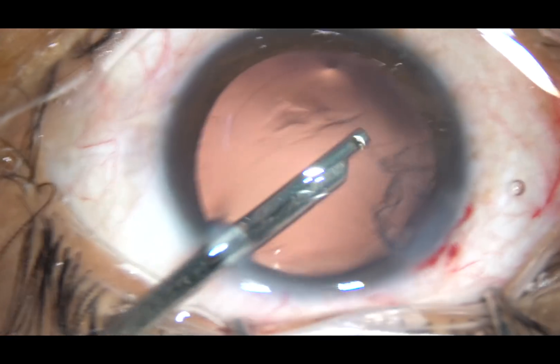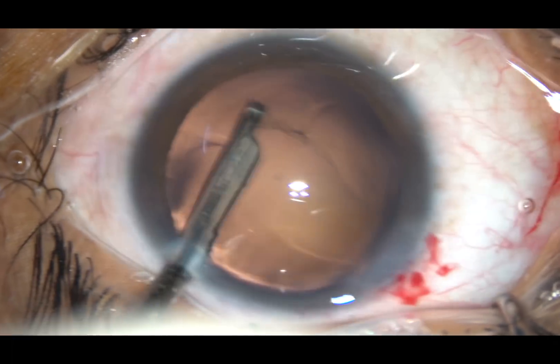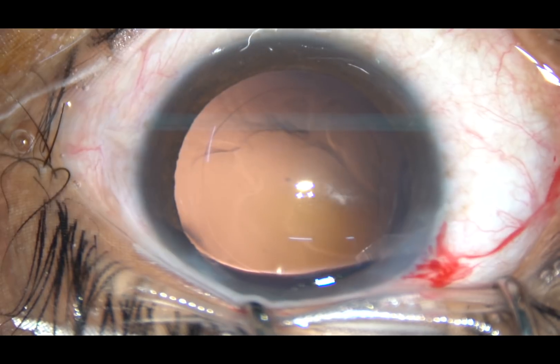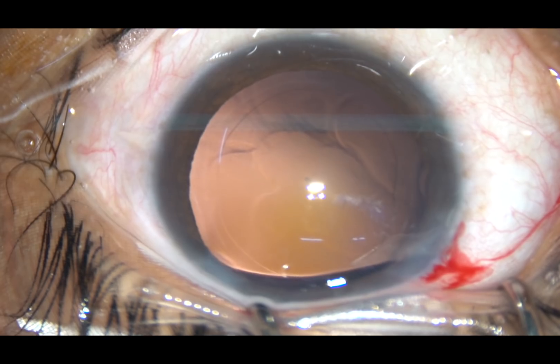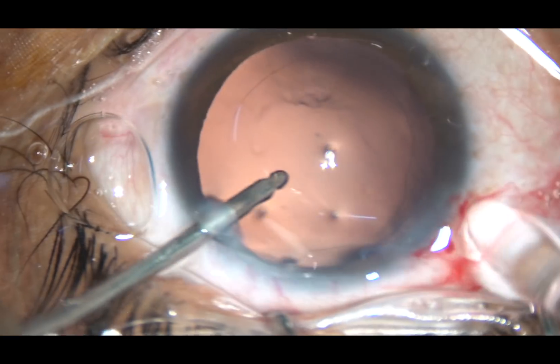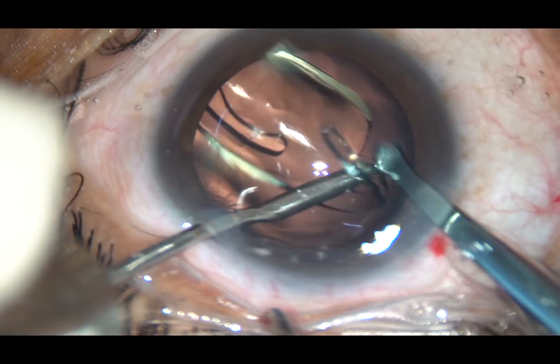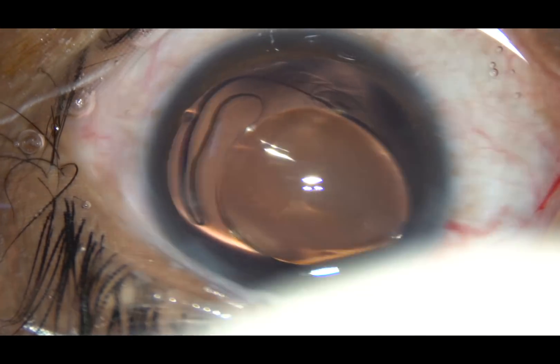Go through this side port, which is about 1.5 millimeters in size. A foldable intraocular lens is being implanted under irrigating fluid. This is a hydrophobic single-piece intraocular lens. The leading haptic goes into the capsular bag, and the trailing haptic is also placed in the capsular bag.